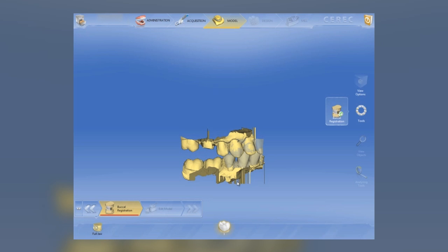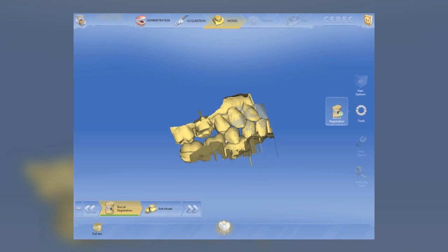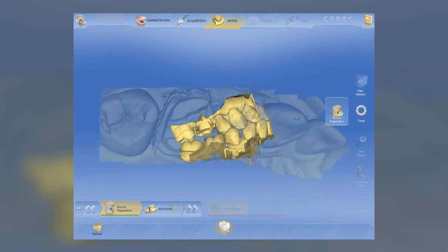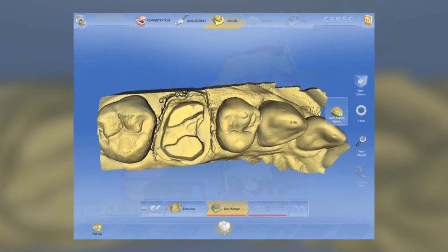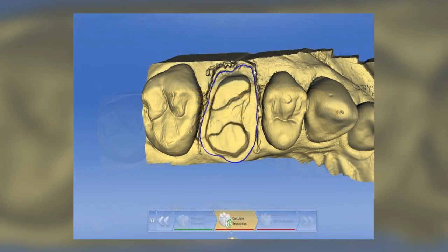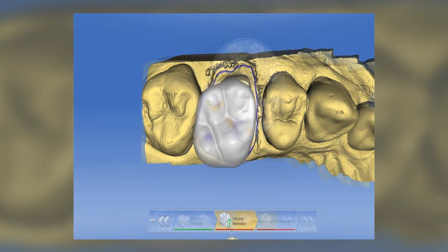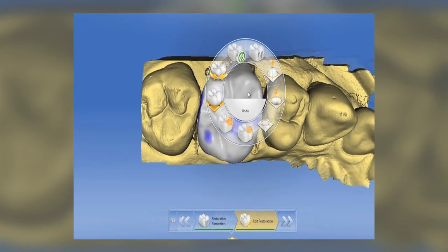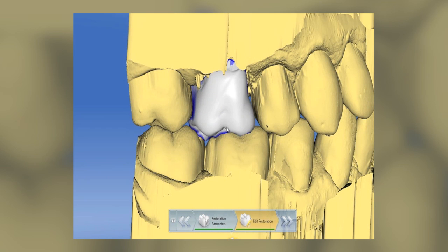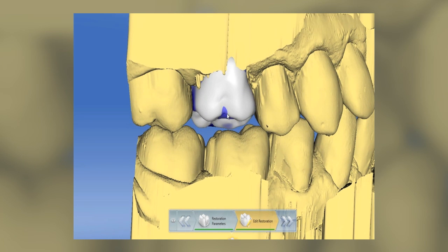Now we'll go ahead and marginate. Once the margination is done and you've set your insertion axis, the proposal is rendered. You have some incredible tools that you can use to modify the restorations with. Here I'm using the move tool. You have quite a few new features in the software to design the restoration.